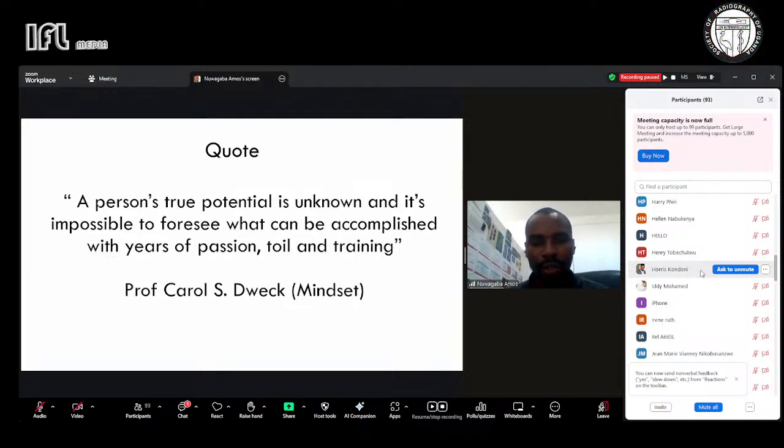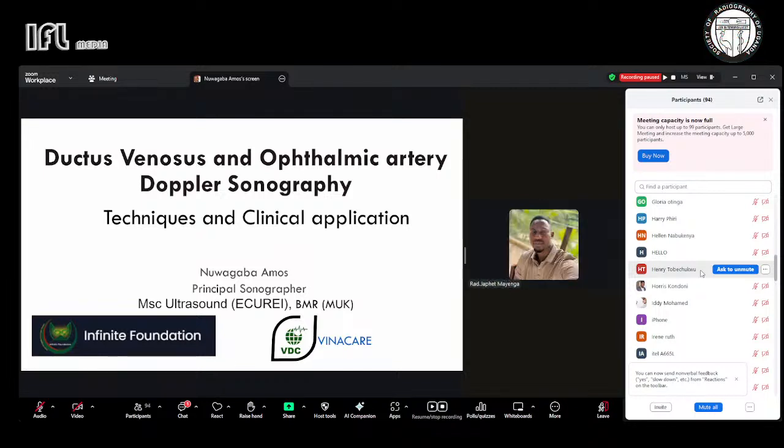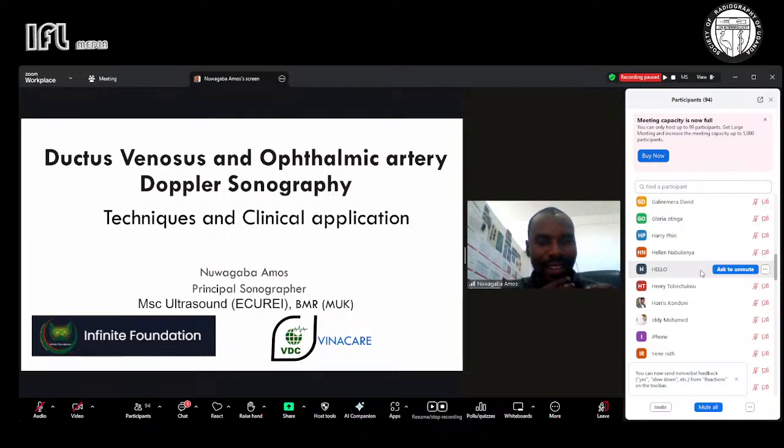And so our talk this evening is going to be on ductus venosus. Sir, your voice is too low. So our talk on this last segment is going to be on ductus venosus and ophthalmic artery sonography.